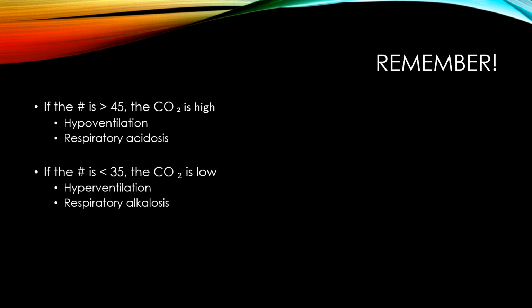Okay, so remember, if the end tidal CO2 reading is greater than 45, your CO2 level is high. This is usually caused by something that's causing hypoventilation. If you're hypoventilating, you are retaining your carbon dioxide because you're not blowing it off effectively, and this will make you more acidotic. It is respiratory in nature, so this client will be in a respiratory acidosis.